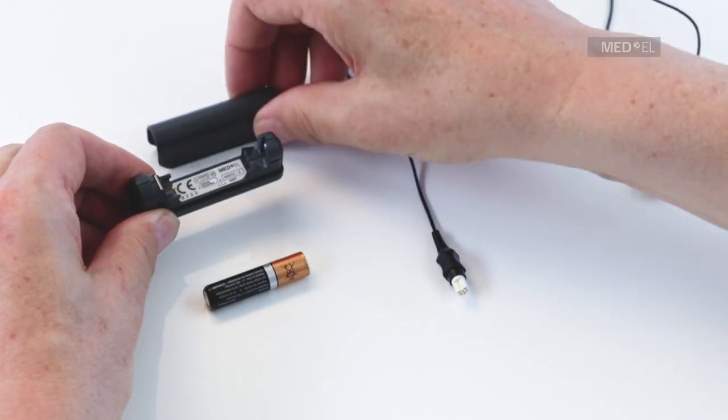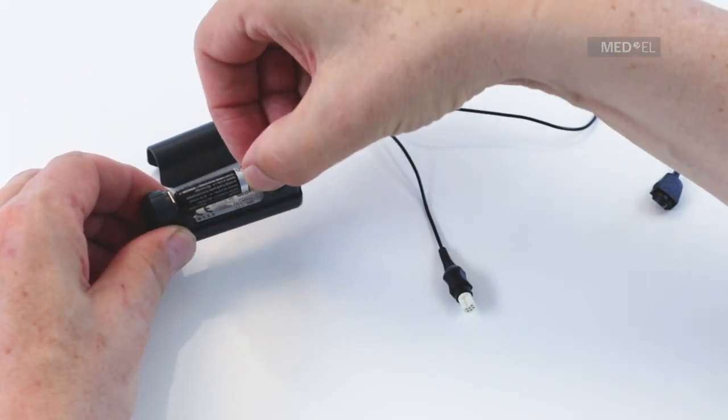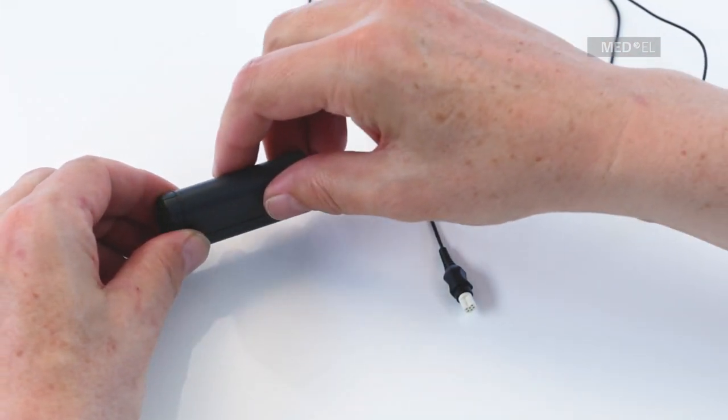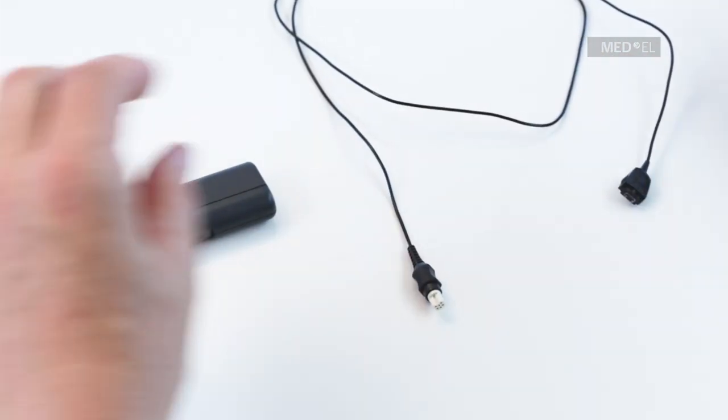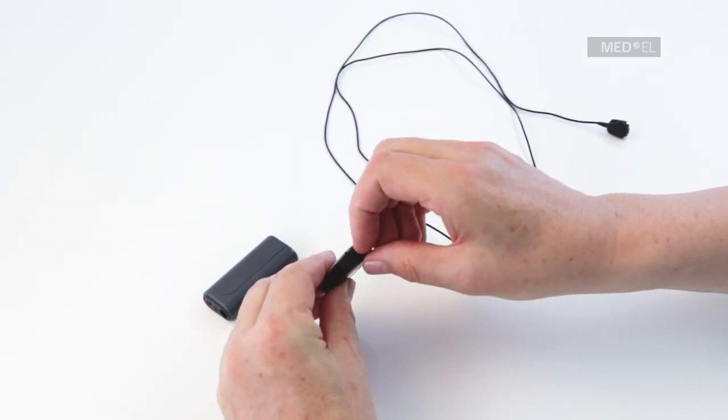Insert a AAA battery or Decapo Power Pack into the Mini Battery Pack. Pull gently on the rubber socket cover at the bottom of the processor to open the Mini Battery Pack port.